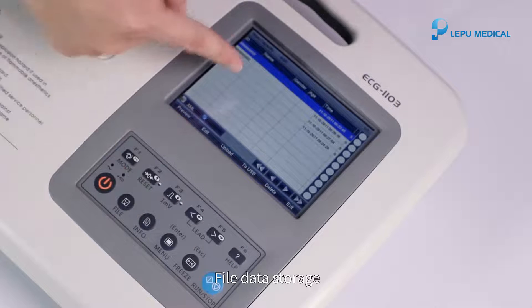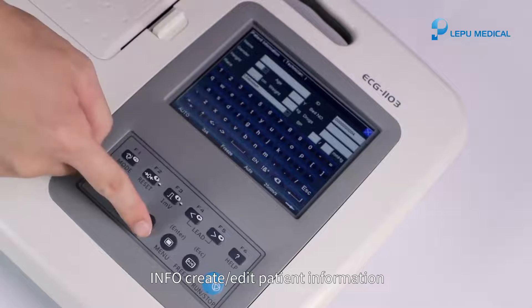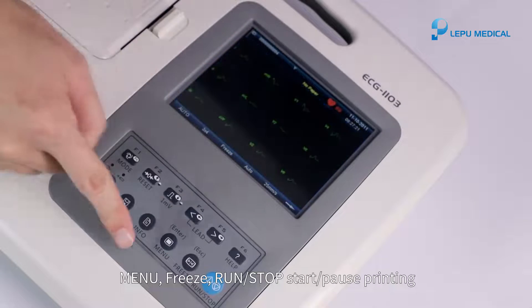File data storage. Info: create or edit patient information. Menu, freeze, run/stop — start or pause printing.